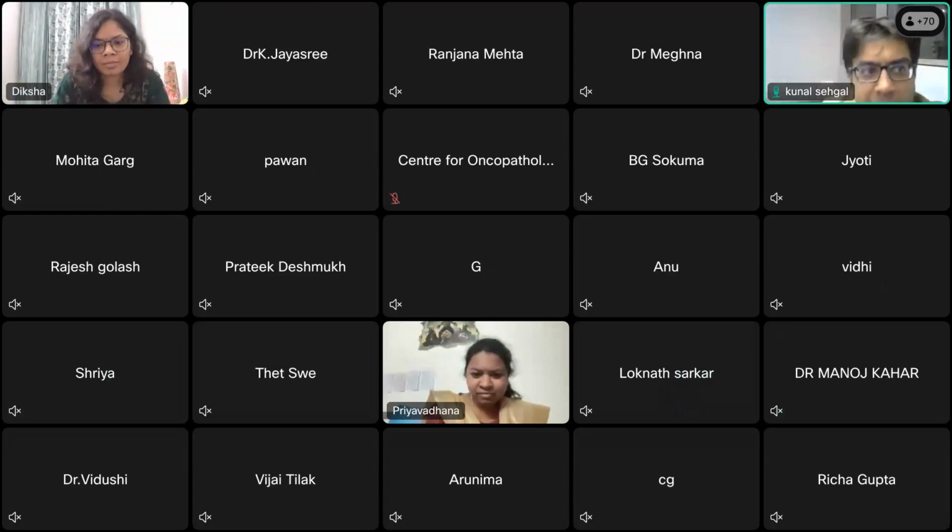Thank you, sir. It was a wonderful talk by Dr. Anil on a very important topic in day-to-day practice. For students who are not used to these slide review criteria, who have not done this in your day-to-day practice yet, I would request that, as every lab has a cell counter, you go back to your cell counter and check. There are different things around your counter. So I would request you to check what kind of flags there are. Dr. Anil started his talk with the slide that said get used to your cell counter, the asterisk marks, the plus marks, the minus marks. That is number one. You should know what those remarks or alphabets mean on your cell counter.